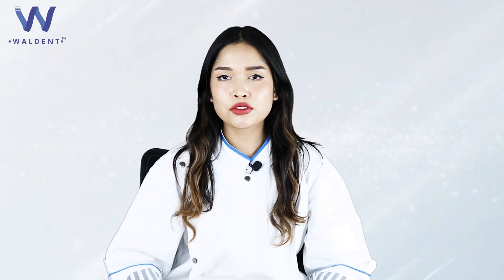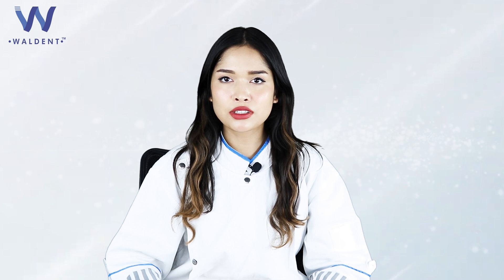Hello everyone, today our product of choice is the Walden Ceramic Crown Conditioning Kit.